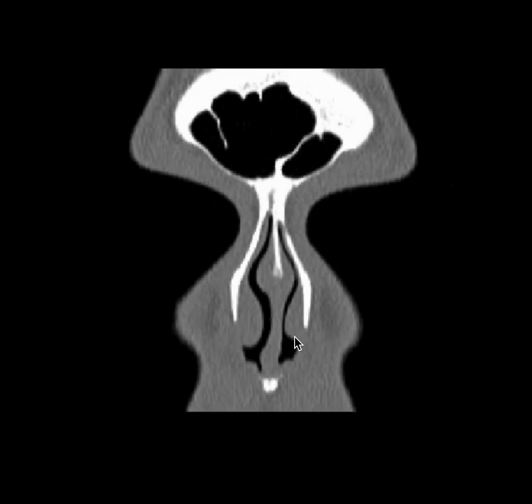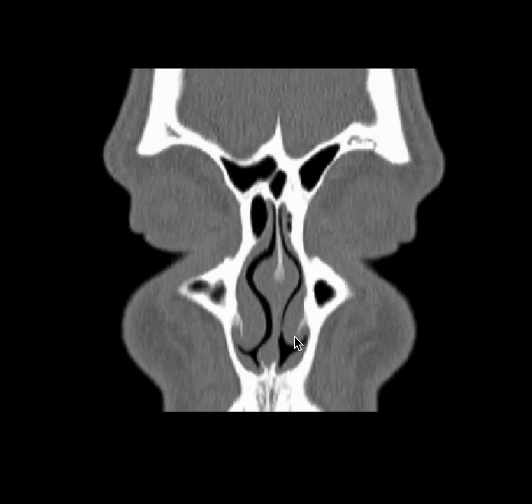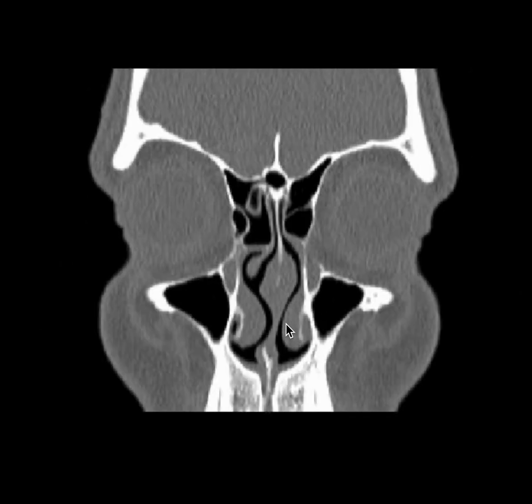Going posteriorly, now we start seeing the air cells. The orbit is seen. We can still see the septum and now we start seeing the inferior turbinate. Coming from anterior to posterior, the left side is slightly compromised. Now we start seeing also the agger nasi — that is the air cell. And then there are a lot of ethmoids that start appearing.